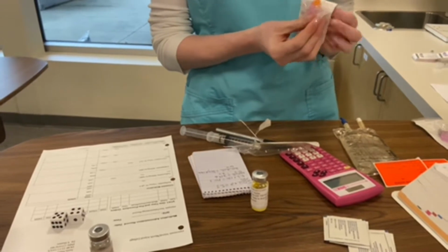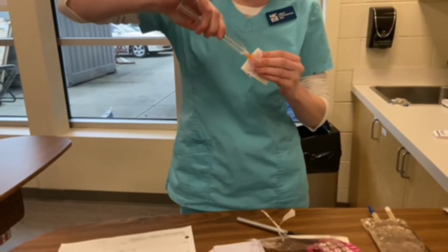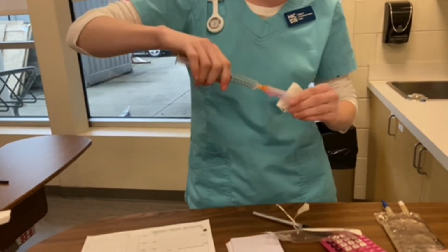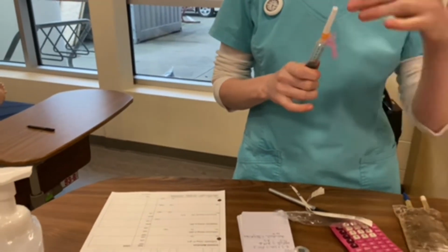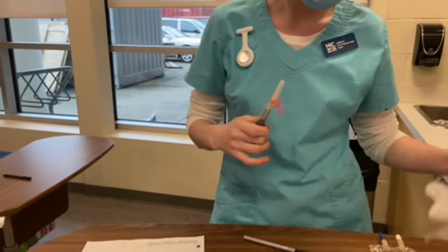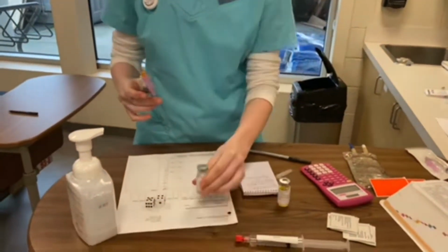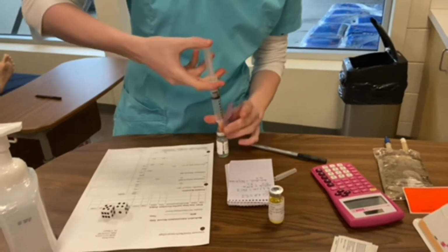I open this and screw this on without touching any of the parts that will touch the patient. Now I remove the safety feature and remove the cap. And now that it's dry, I inject 8 ml of air.